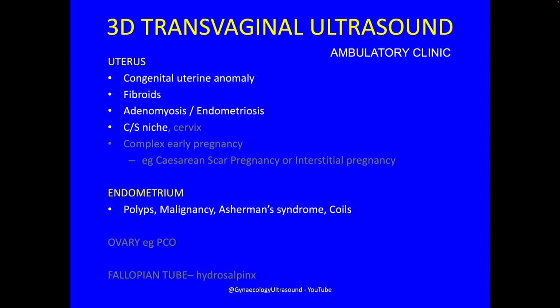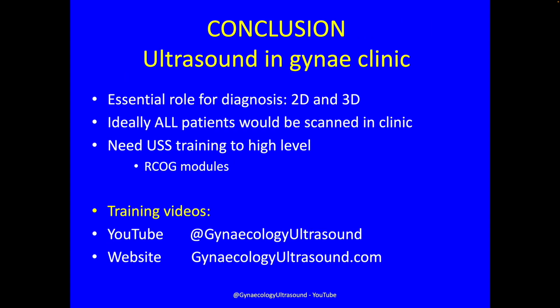So 3D transvaginal ultrasound in the ambulatory clinic was most useful for all these different applications and indications, but 2D is obviously extremely important as well. Ideally, I think all patients would be scanned in clinic, but of course we'll need to be trained to a high level, and the RCOG has modules for this, and I have a lot of videos online.